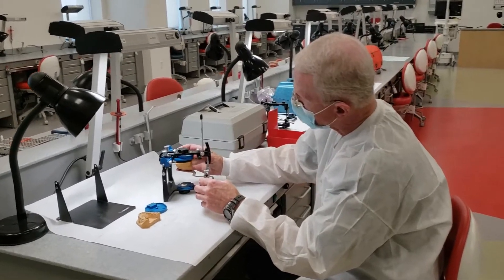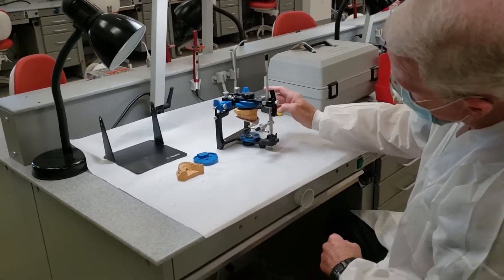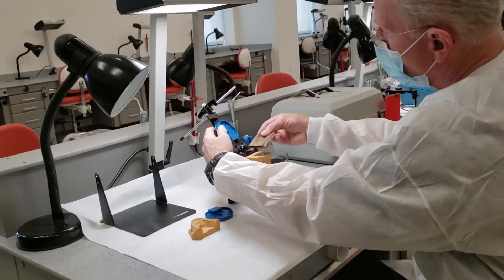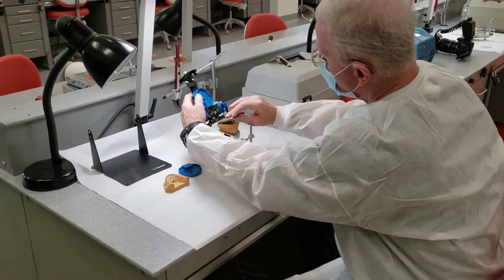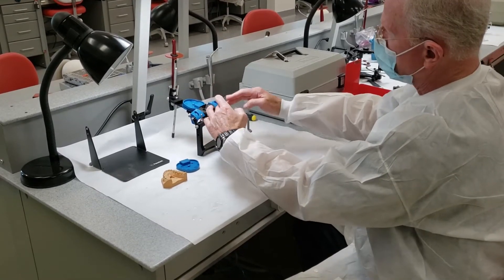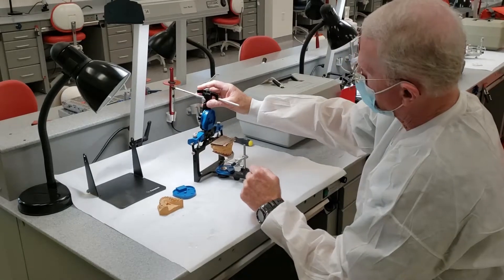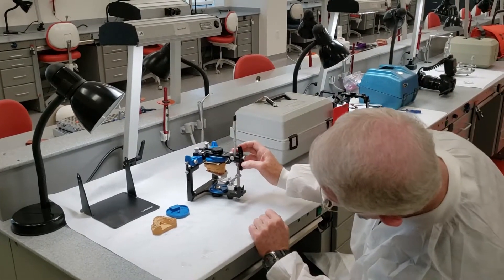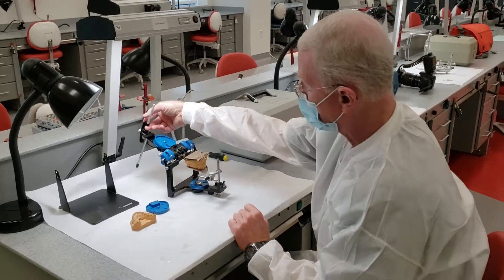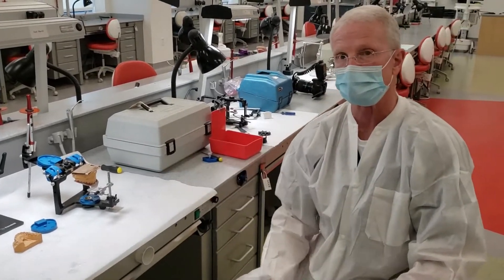We'll set our maxillary cast there and kind of estimate how much space and how much stone we need. It's a good idea to pre-soak the cast. I've got just a paper towel here that's pretty wet — I'm going to set it on top and again, I've estimated how much stone I'll need. We'll mix that next and I'll be back while this sets for maybe just a couple of minutes, then we'll dry off the surface.